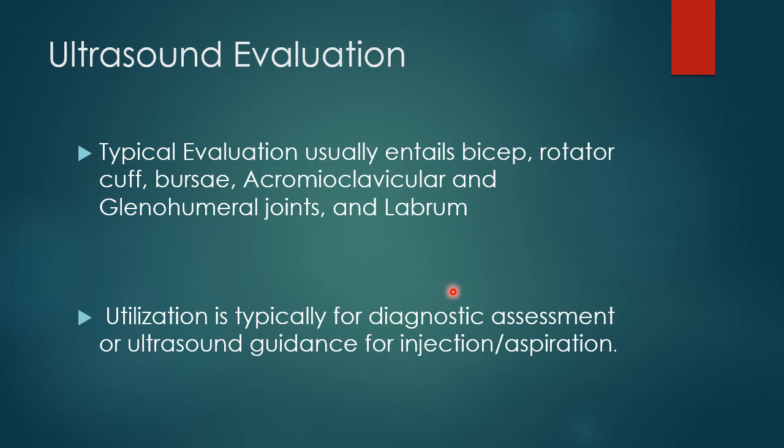So as said before, it's used for diagnostic assessment of rotator cuff tears or any shoulder lesions, as well as ultrasound guided injection or aspiration.